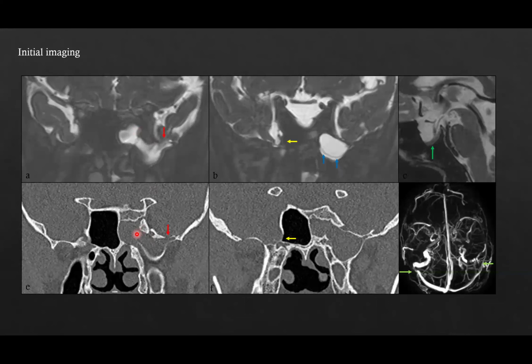So this encephalocele was possibly the cause for his CSF rhinorrhea. If you look at the opposite side, there is an intraosseous meningocele, meaning the bone is still intact. There is no herniation of the brain or meninges through the defect, but there is marked thinning of the bone. So you have an intraosseous meningocele or encephalocele with the intact bone.